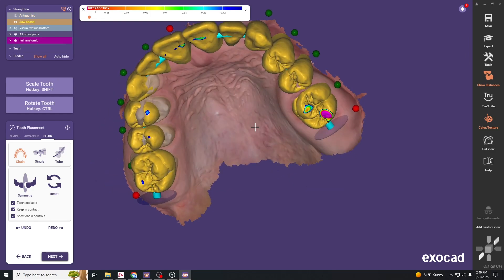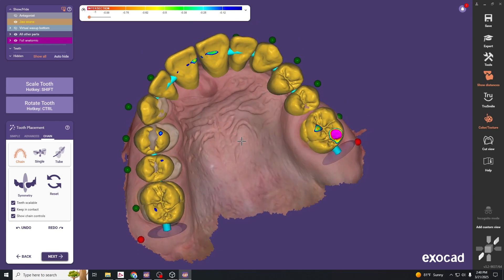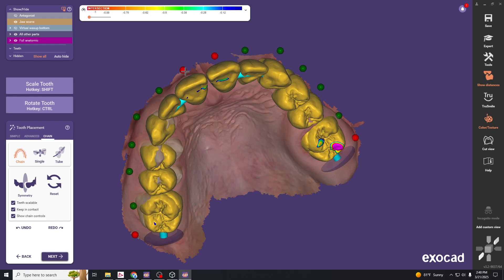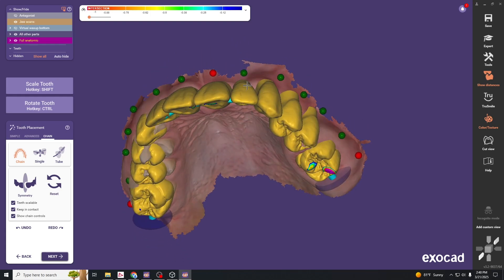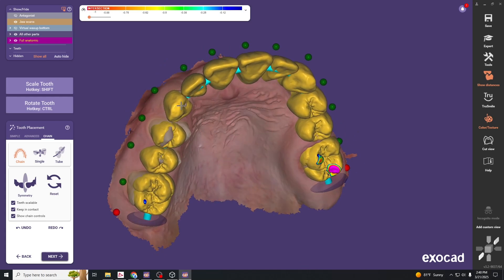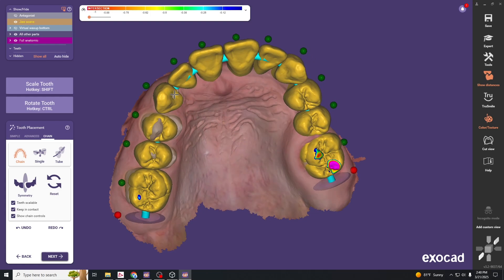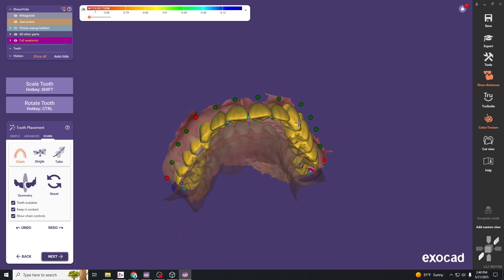From there you can do some fine-tuning movements of the other surrounding segments. In this case, move the canine so it's a little closer to where it should be. From 3 to 6 that looks relatively okay, so lock that in place, then move this segment back to the arch form.